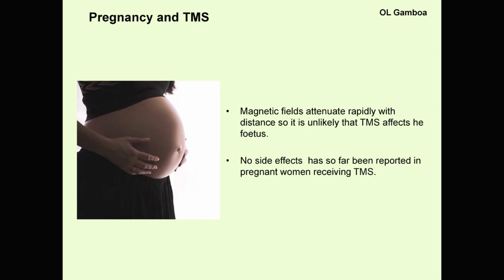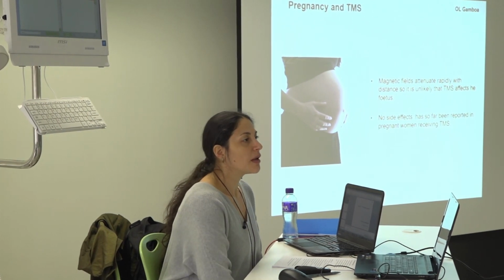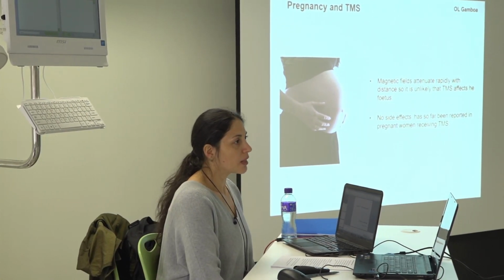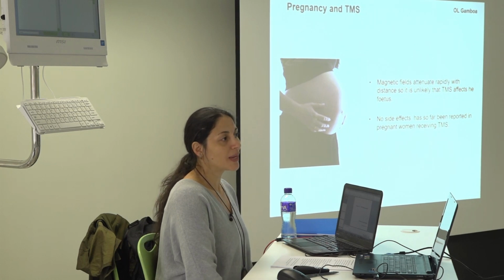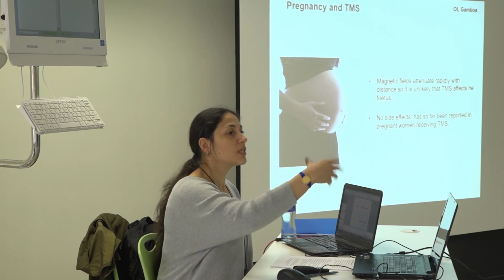Pregnancy, okay. So they worry like, okay, I'm pregnant and maybe something will happen. No, there has not been anything showing that TMS will cause any damage, but it's recommended that the pregnant woman will not be measured, and the operator will be 70 centimeters away from the coil. That would be the recommendation. And unless you really have to do the TMS, it's recommended not to do it.